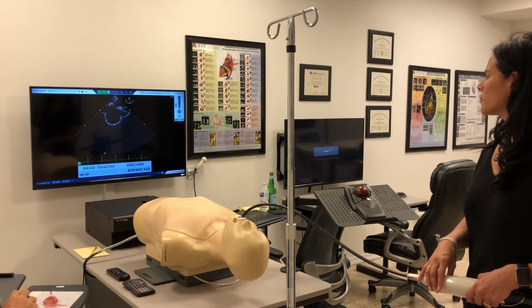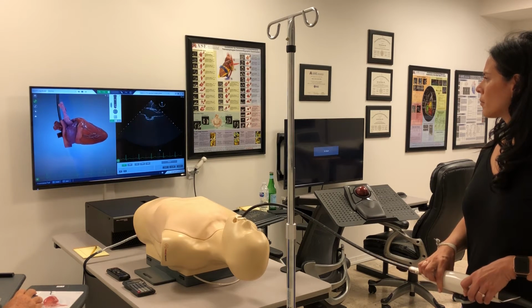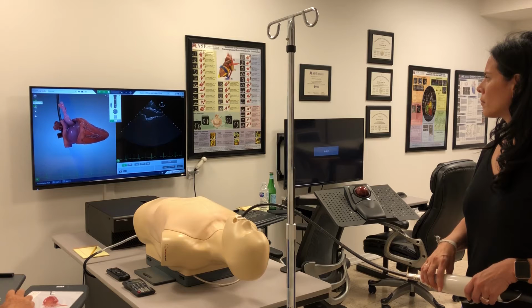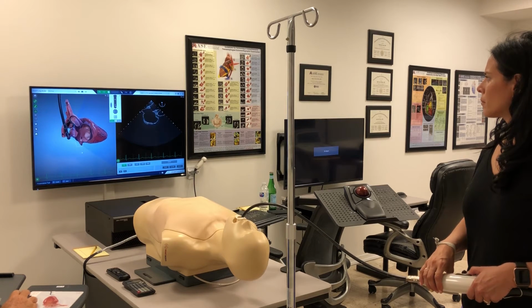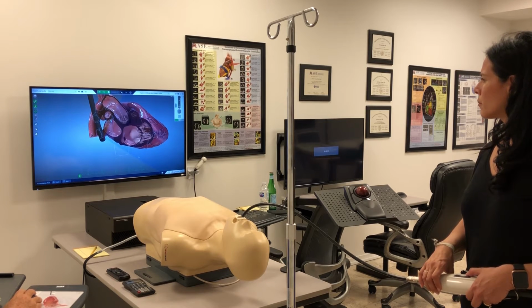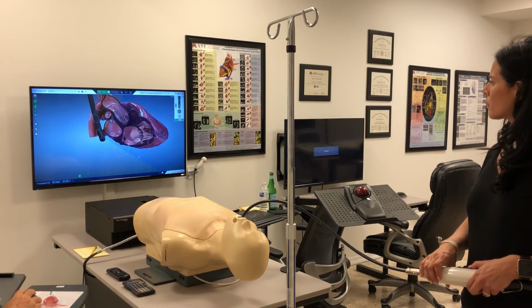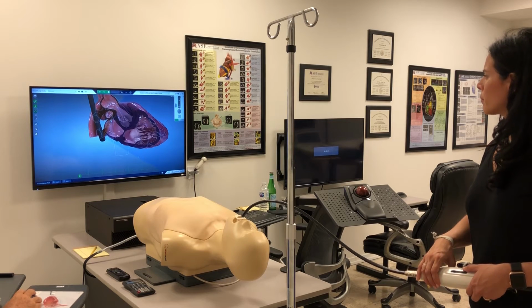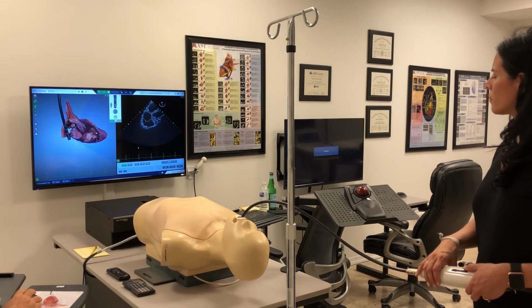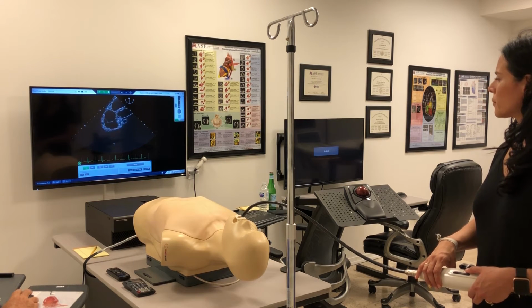Good. Now let's develop the modified bicaval view, which is simply a turn, and you kind of have to decide which way to turn. Let me just kind of cut into the heart here and show you where you're at right now. Here you are in the bicaval view. Let me just zoom in on this. You can see the inclination plane, which has cut the heart, and you can see that the tricuspid valve is going to be a left or counterclockwise turn, just like you're making now. So now that you've done that, you'll have developed the so-called modified bicaval view, which is right there.